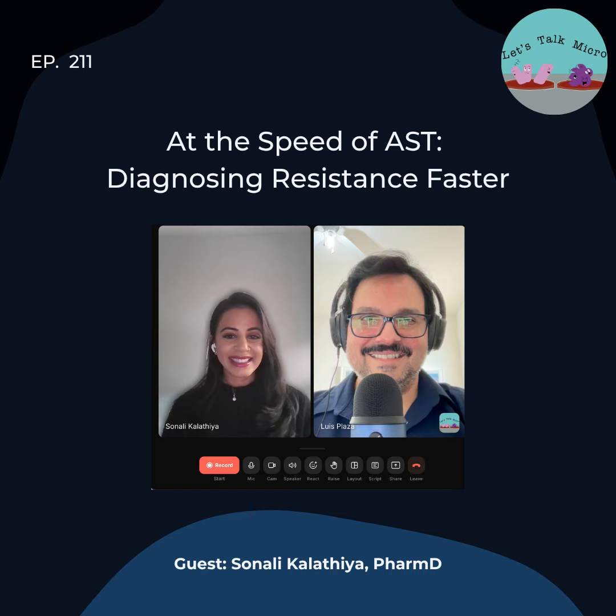We have to adjust our process. But then again, things change and we can do that. I even remember when we brought MALDI on, adjusting your brain and your workflow was a little challenging, now knowing that you had that answer. So sometimes you even work backwards because you're trying to find out what you have and then tailor the workup according to that. So we get through them. It's just one thing that I wanted to mention.